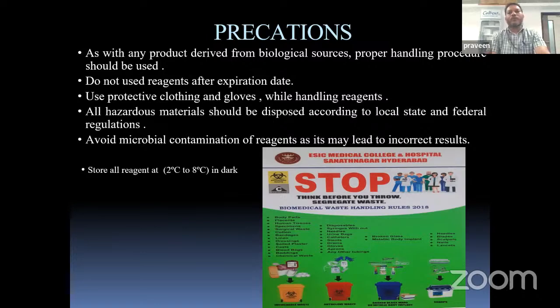Now, what precautions should be taken? As with any product derived from a biological source, proper handling is required. Do not use reagent after the expiry date because it will not give a proper result. Use protective clothing and gloves while handling the reagents.